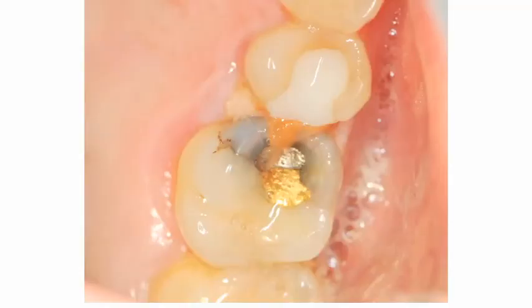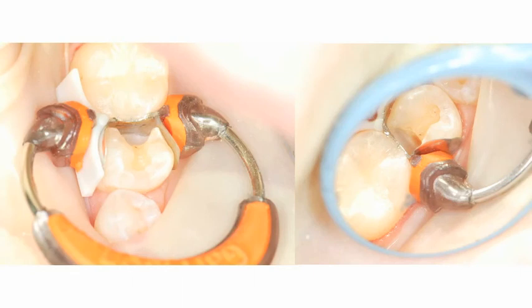Utilizing Danville's ABC Wedge system allows you to think differently. Here is a clinical situation where the patient is constantly getting food stuck between the molar and bicuspid. Traditional dentistry would be to restore the tooth with a crown, but now we can use a posterior composite and restore this tooth back to form and function, maintaining a tight flossable contact. The ABC Wedge can be used with any of the currently available separating ring systems. Placing the ABC Wedge proximally before seating the ring prevents the ring from crushing the matrix band into the preparation.